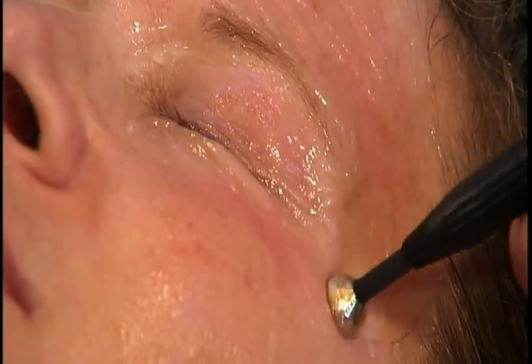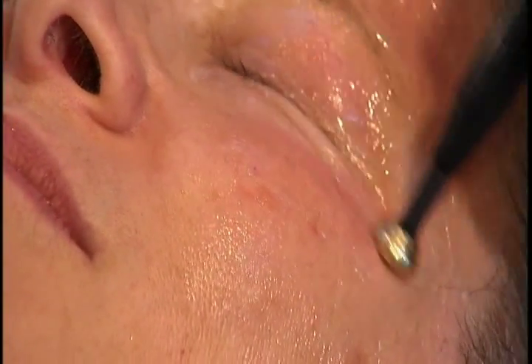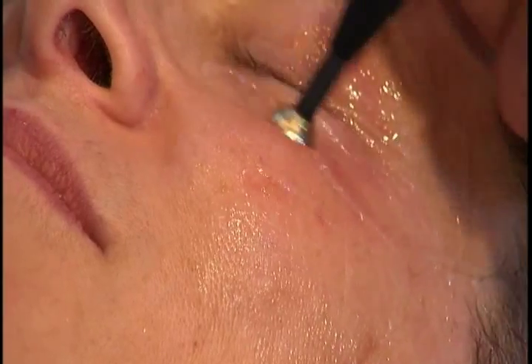Notice we haven't had to change the energy level. We found a nice happy place with the energy level, and instead of having to dial up, dial down, we're just able to change our intensity by how slowly we move and how much area we cover at a time.